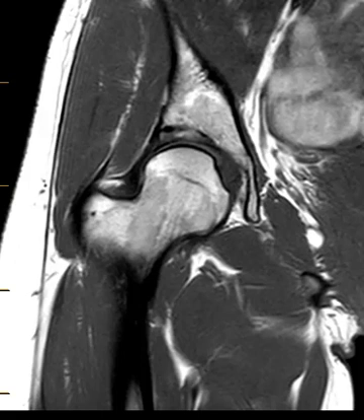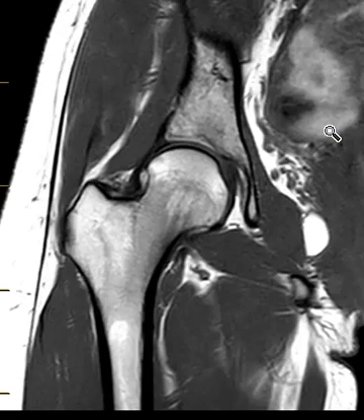Hello, this is Dr. Gay from First Look MRI. This is a 20-year-old female who had been playing and wrestling with a friend, hurt her hip, and came in for an MRI.